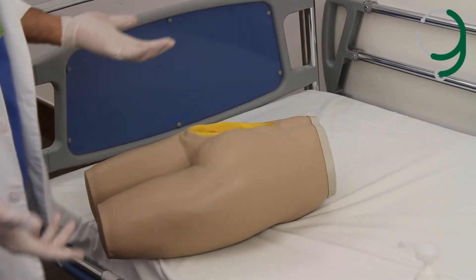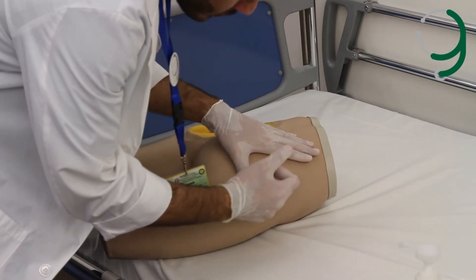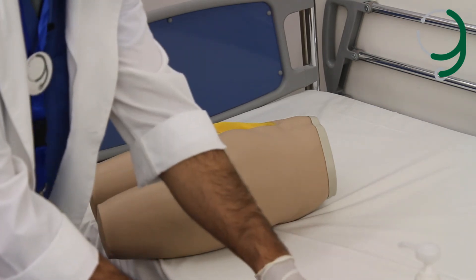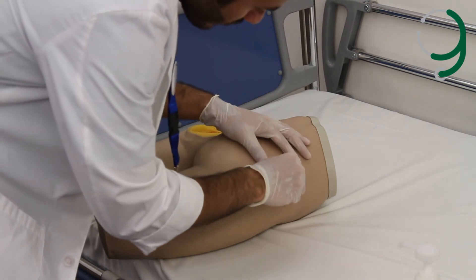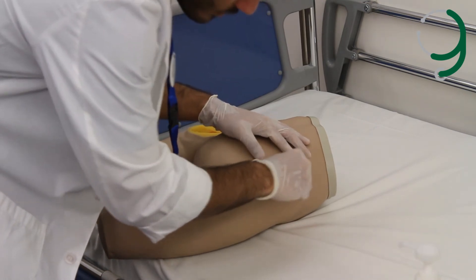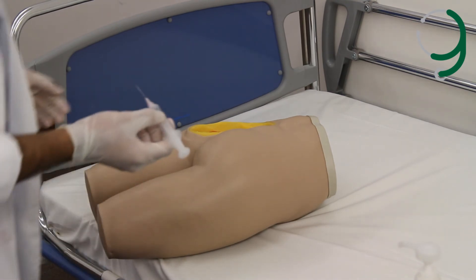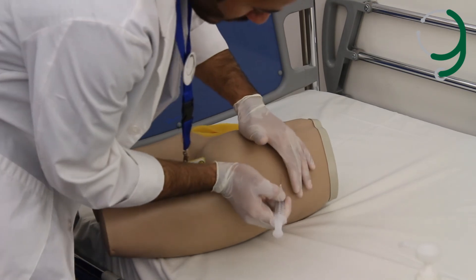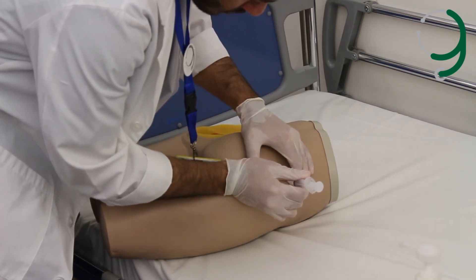For the dorsal gluteal region, we determine the site first — we go for the upper outer quadrant of the buttocks. We do the very same thing: wipe the area three times in a circular motion. We use the Z-track technique, stretch the skin just a little bit, and inject at a 90-degree angle quickly to reduce the pain.